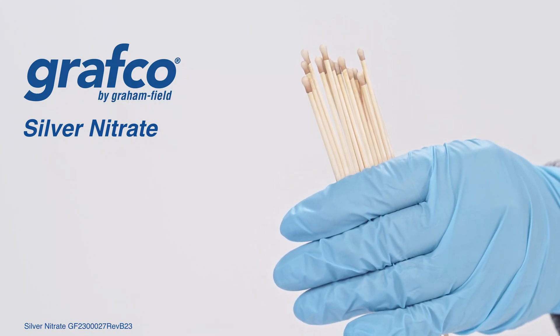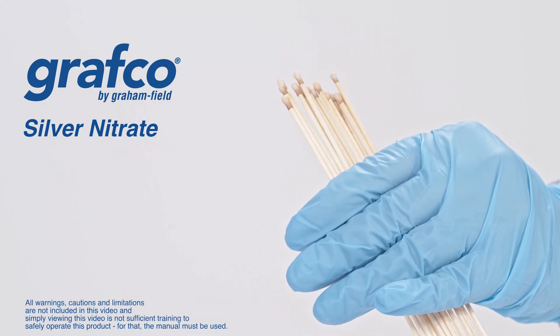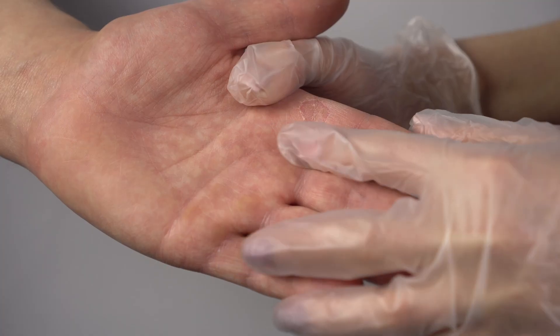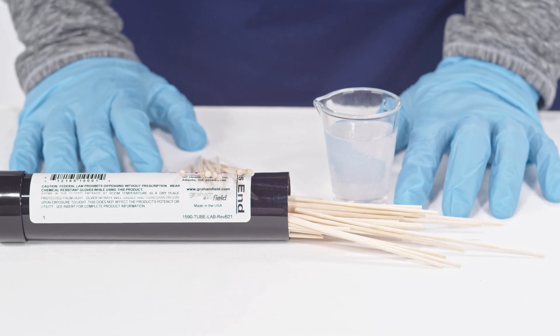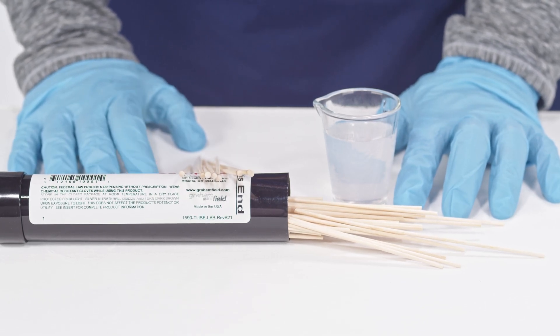Grafco silver nitrate applicators indicated for cauterization of skin or mucous membrane and for removing warts and granulated tissue. Grafco silver nitrate applicators come in 6, 12, and 18 inch applicators.